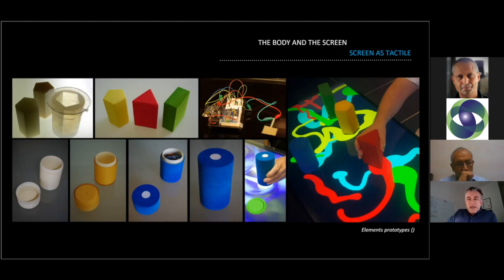The main objective of rehabilitation and therapeutic exercises is improving the patient's motor functions and maintaining their physical skills. However, as most rehabilitation exercises are repetitive, essentially performing the same motion multiple times, patients are often not motivated to continue after their initial treatment.